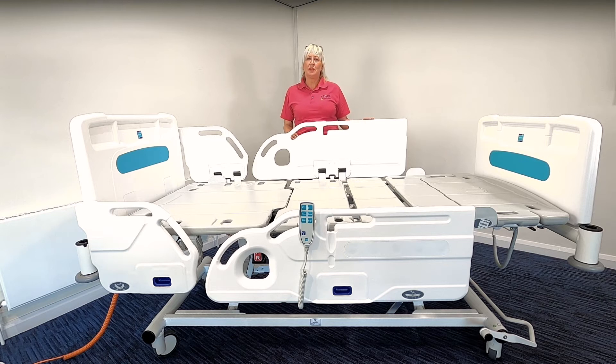Hello, today we're going to be demonstrating the Innovate IQ bed. This is a bed which is suitable for general ward area use and also high dependency settings.